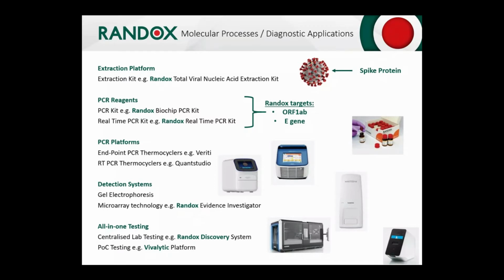So specifically, we looked at the E gene, which is a test that looks for all different beta coronaviruses under the subgenus Sarbecovirus. So any SARS-related virus, SARS-CoV-2 specifically, as well as SARS-CoV-1. And we also looked at open reading frame 1AB, which is uniquely specific to the SARS-CoV-2 virus.